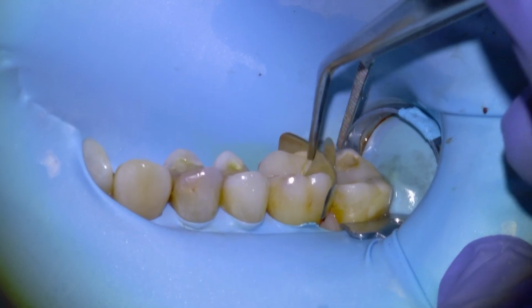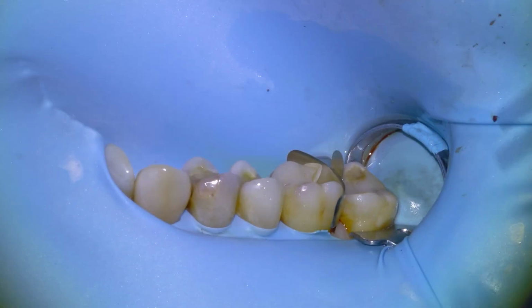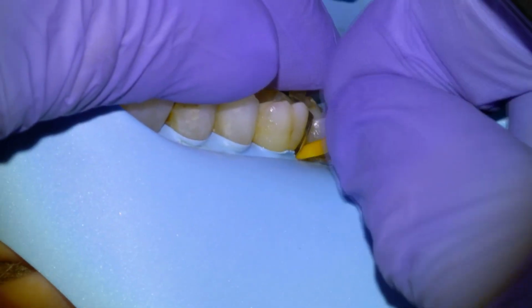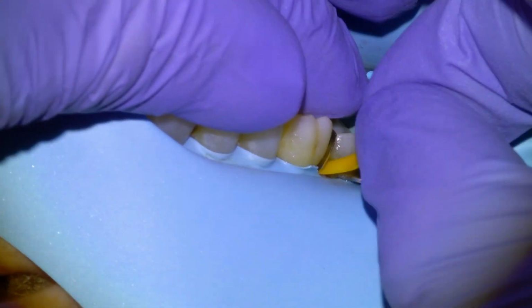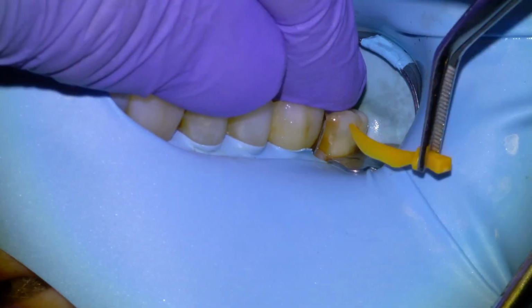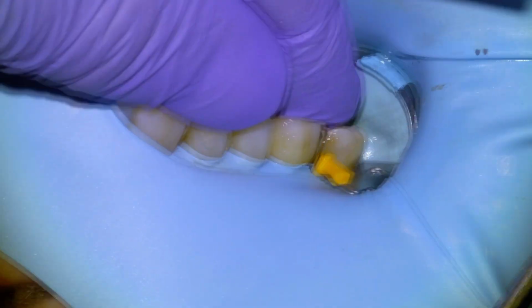Gonna place this sectional matrix as apically as possible and then stabilize it with our large plastic wedge. I like to apply apical pressure to the matrix band and wiggle the wedge in and out to allow the band to seat as deeply as possible.